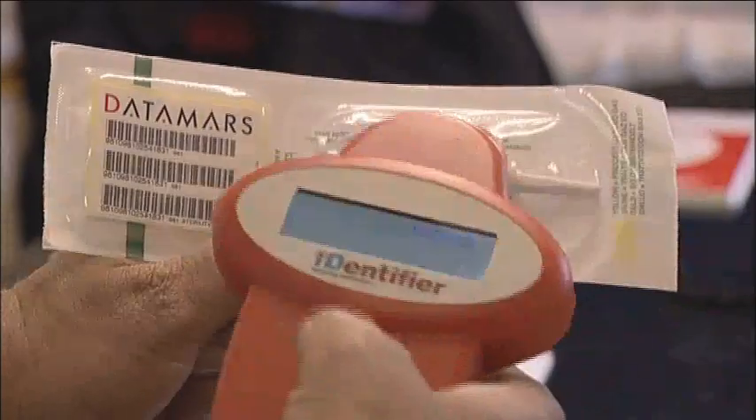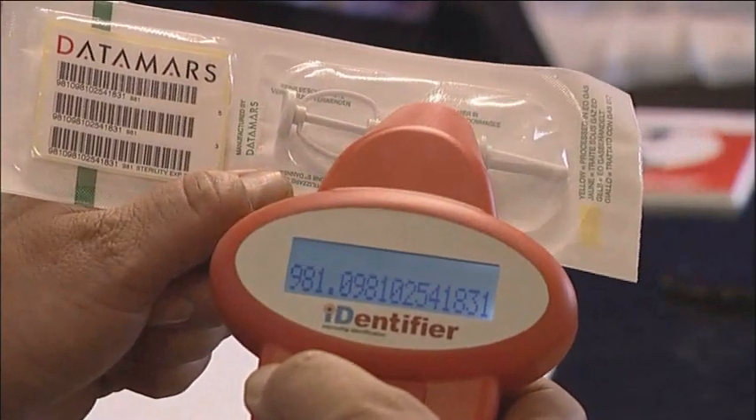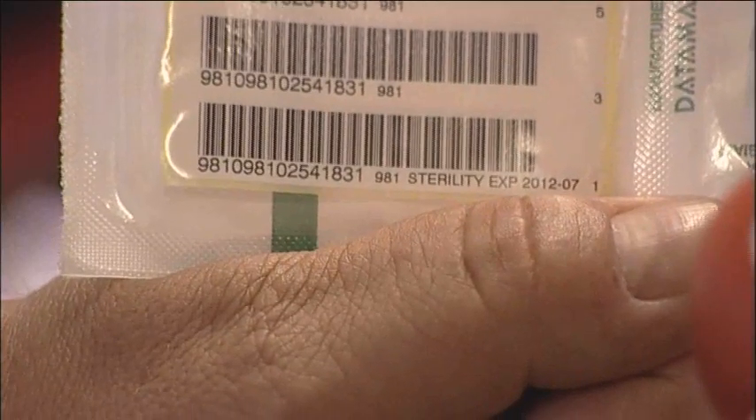Take the packet containing the microchip implanter and the barcodes and, using the scanner, scan the microchip to make sure that the reading on the scanner correlates with the barcodes in the packet.